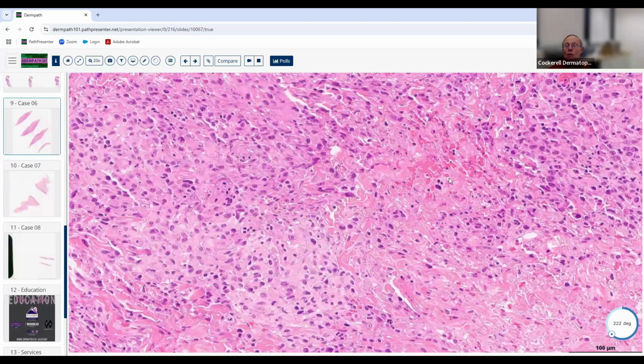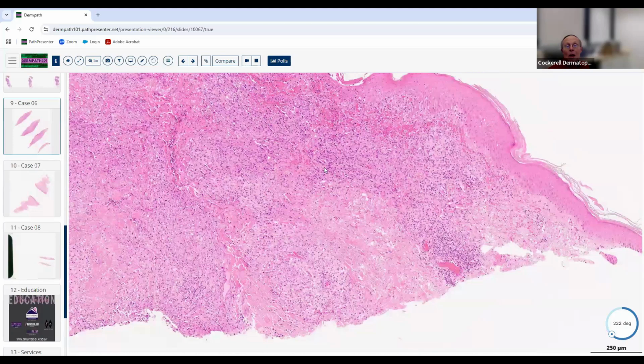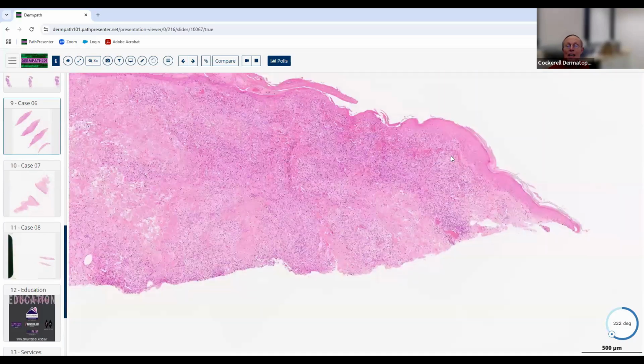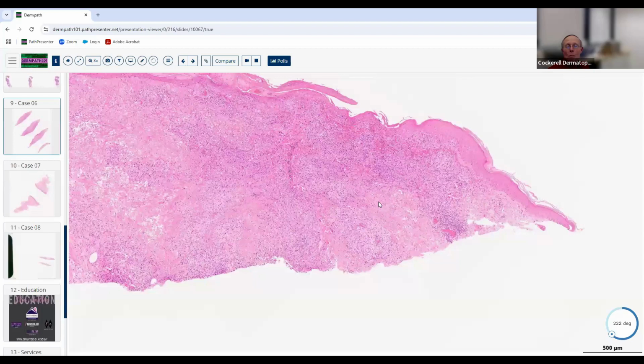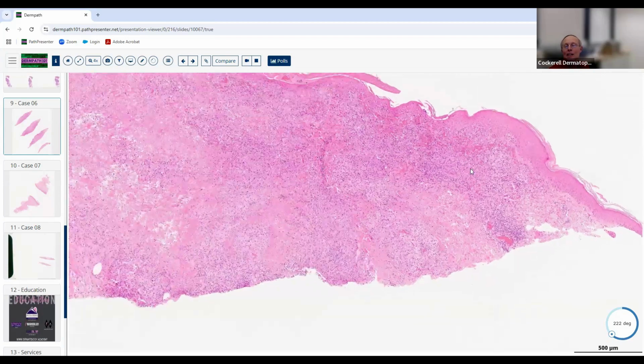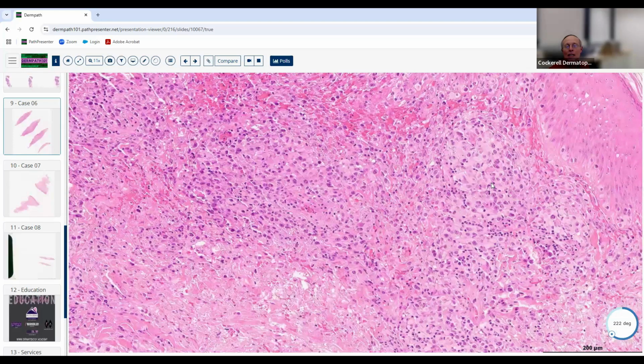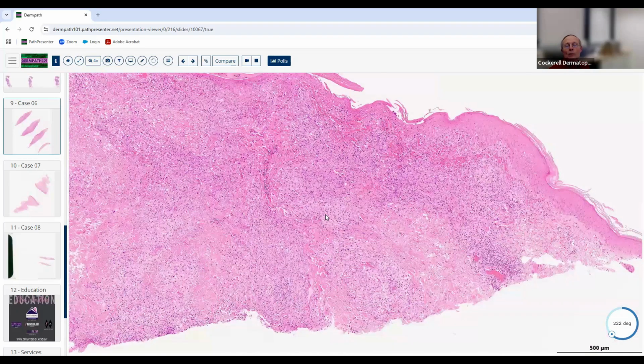And you have to look away from the necrosis to these areas where you see the atypical lymphoid cells to really make the diagnosis. And in a situation like this, we would probably do a stain. Which stain would we do here? That's the one the board might ask you to do. They might show you this slide, which is too hard to get without any history, and then show you another picture with the label of the stain on it and ask for the most likely diagnosis. Maybe a CD30 stain. Yes, CD30. So this is a CD30 positive lymphoproliferative condition.